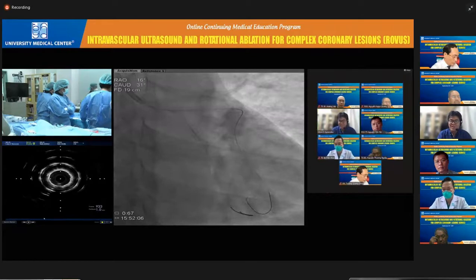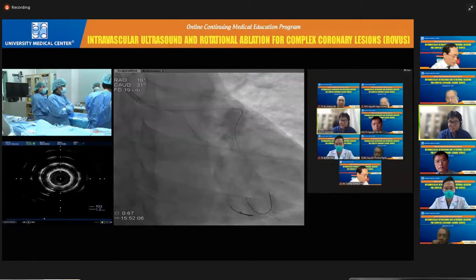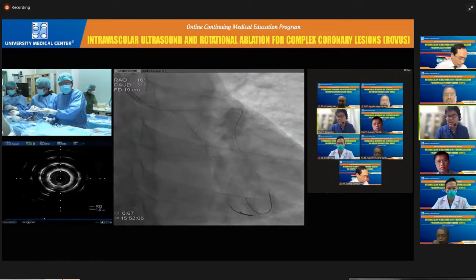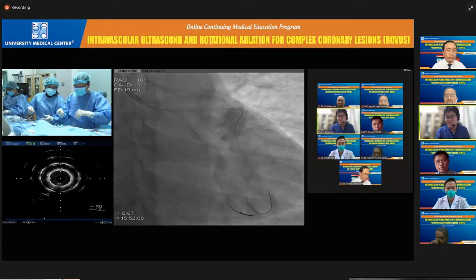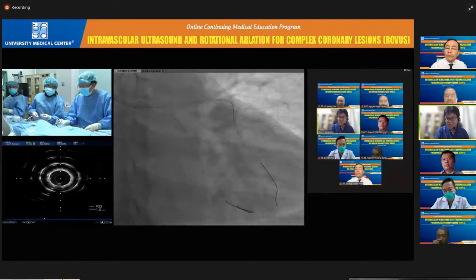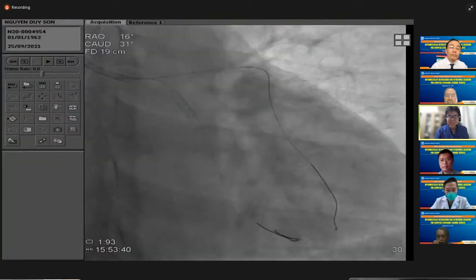In most cases, stent deformation occurs. So, I'm not sure, but to get optimal two-stenting, OCT-guided PCI is maybe better, because OCT makes a 3D image, so we can easily understand the location of stent struts. Of course, there is little evidence showing the benefit of OCT-guided PCI. Anyway, this is my opinion.